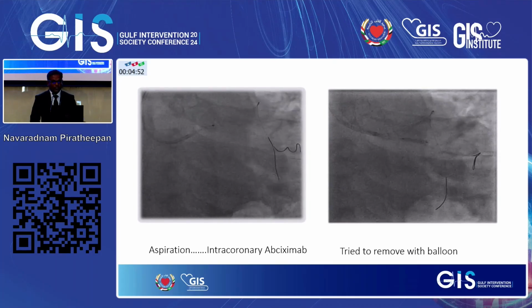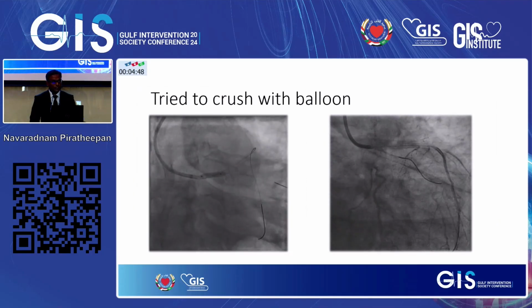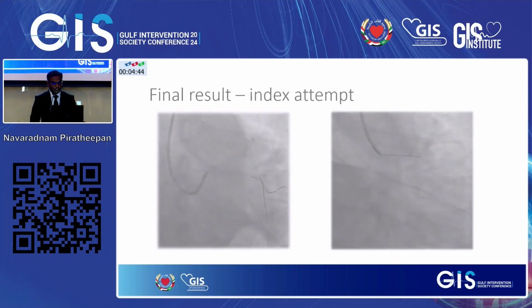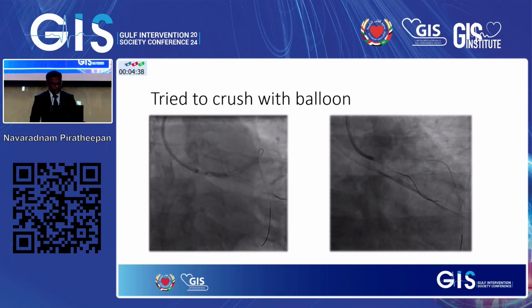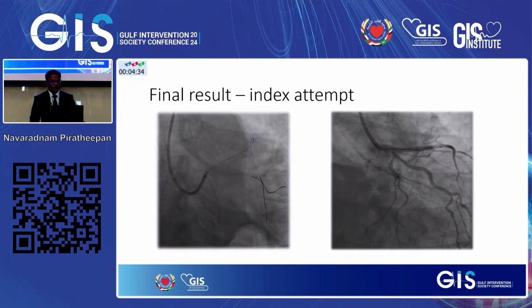The result was the same. Then we tried to crush the balloon material with the same balloon, going up to 8 atm, but the result was the same.